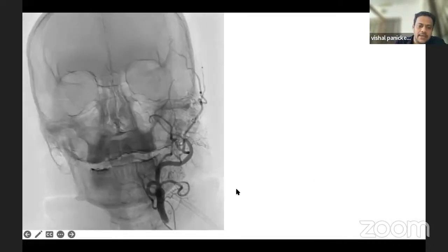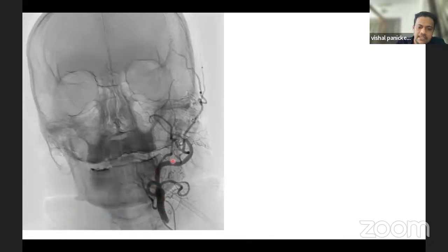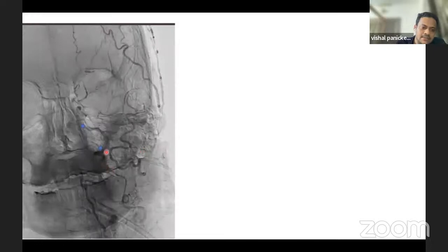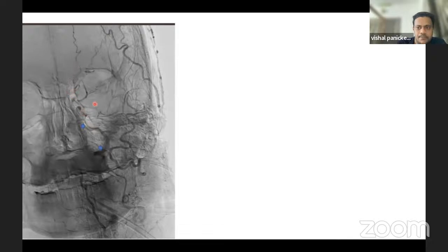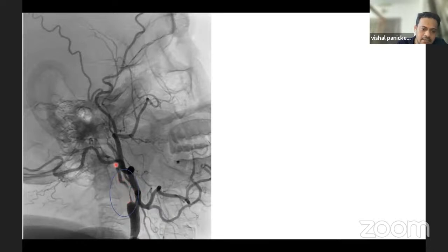We then took a left common carotid shoot. Here we can clearly see the external carotid artery with branches in the cervical segment. The internal carotid artery is not seen in this part. In the later part of the angiography, we can see a streak of contrast flowing through the internal carotid artery, but the distal part is not clearly visible. In the lateral shoot, we can see a tight stenosis in the internal carotid artery at the origin, just at the level of the bifurcation, with a small streak of contrast going upwards.